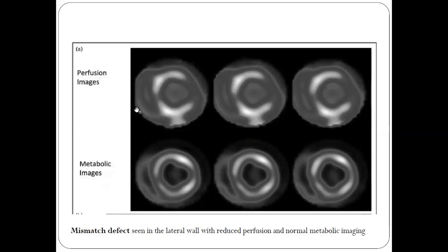You can see here again there is a mismatch defect in the lateral wall. So uptake of metabolic activity is present, but perfusion is not there.